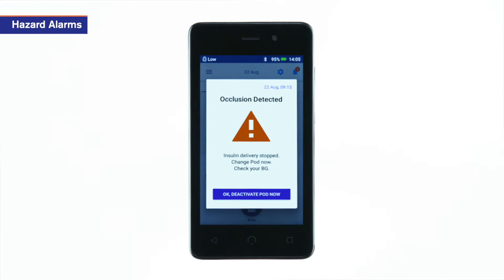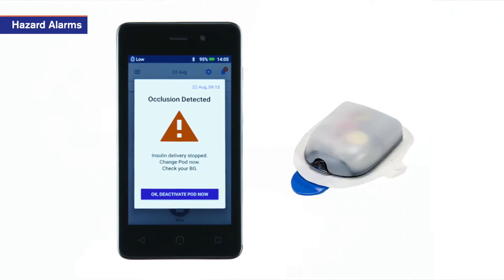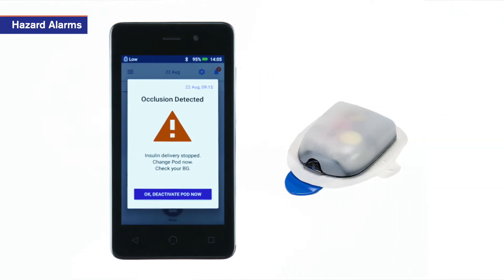Hazard alarms are high priority alarms that inform you of a serious issue that has occurred. Hazard alarms will require a pod change. They are accompanied by a continuous tone to let you know when the pod or PDM requires immediate attention. This tone can come from the pod, the PDM, or both.